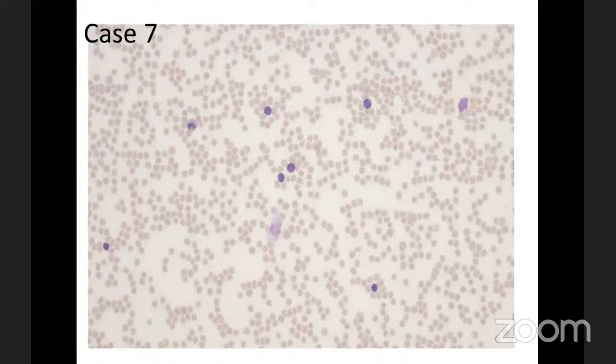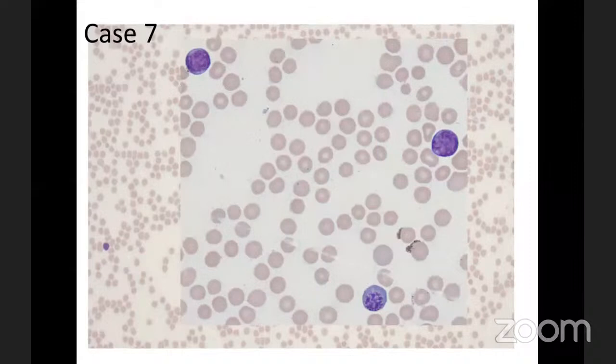You can tell that the patient is not leukocytotic by a low power magnification. But we have a few blasts, small to medium, neutrophils, and basket cells or fragmented cells. The blast looks what? And these are nucleated RBCs. What do you think about the blast morphology? Yes, a lymphoblast. Looks like a lymphoblast.